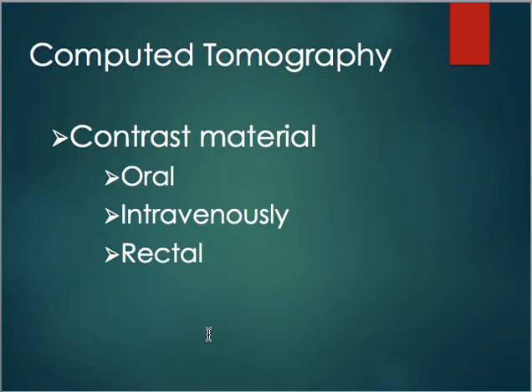We do use contrast material in computed tomography, or CT. So CT contrast is used to make specific organs or blood vessels and or tissue stand out. So with more image contrast, it helps better show the presence of disease or injury. It's really important to use contrast material in certain studies for CT. So again, like I said, CT contrast will highlight specific areas of the CT image, or it dyes it. So we sometimes refer to it as X-ray dye or contrast dye or CT dye because it's actually dyeing the image where we need to see it.